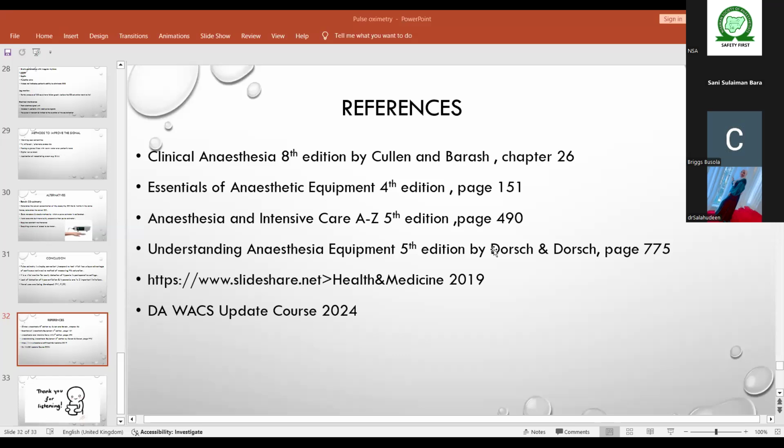Okay, ma. No, I just used it to emphasize the advantage of the probe placed in the esophagus, especially in burn patients. Yes, I agree. There's one more thing I want you to tell me. You have actually mentioned it, but I want you to give a practical, critical reasoning from one of the things you have mentioned and relate it to the burn patient. You have actually done well, Dr. Salahuddin, so don't be stopped.